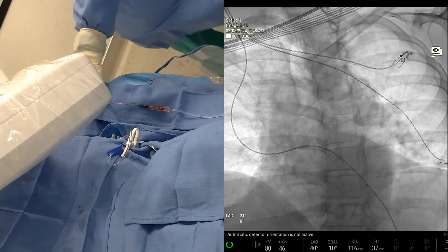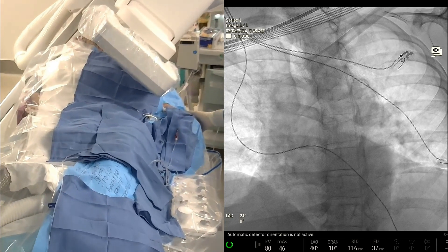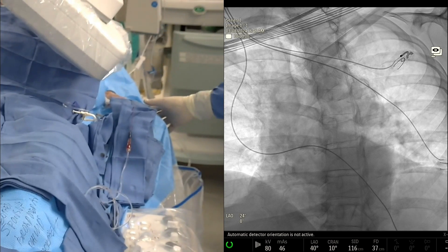I just want to show you where we are right now. Can you guys zoom in on the wrist a little bit? So we have the arm tucked very close to the side. This is our standard approach for radial access, as you guys can see here.